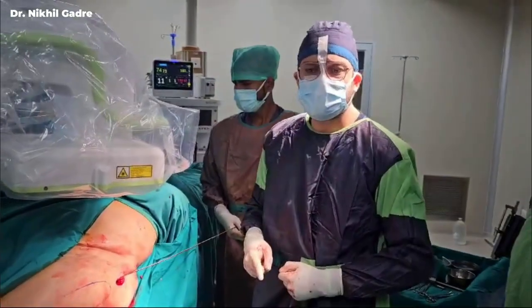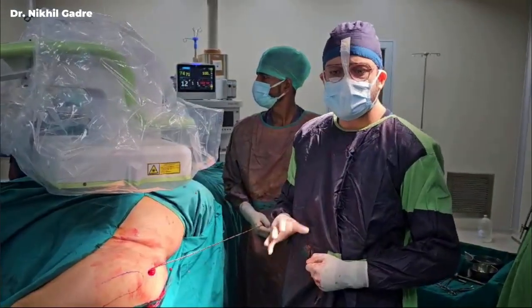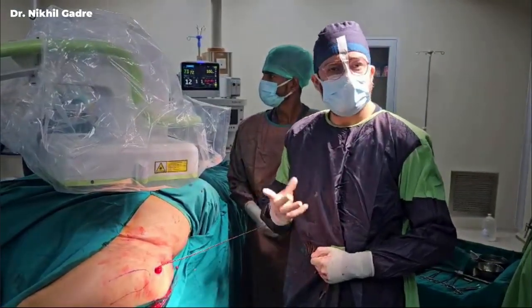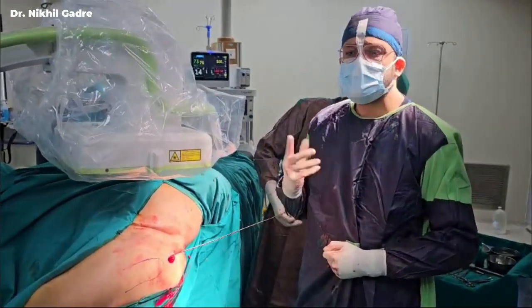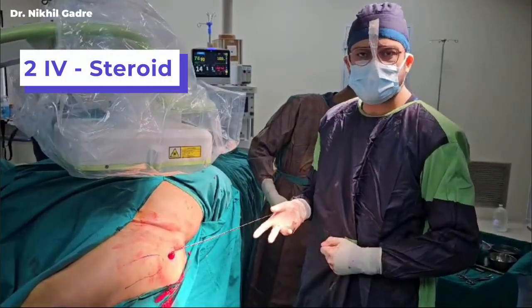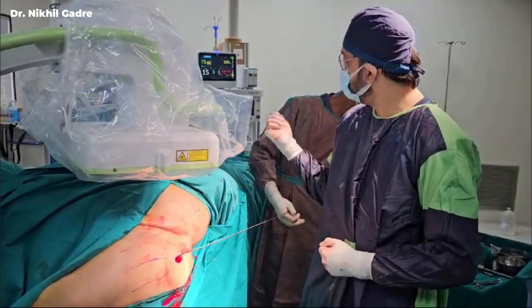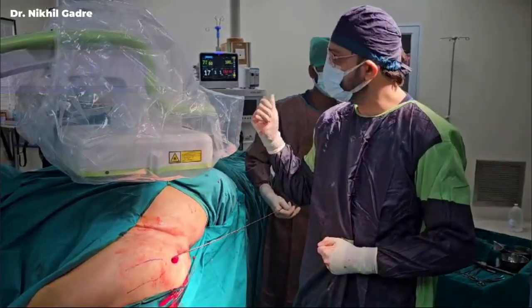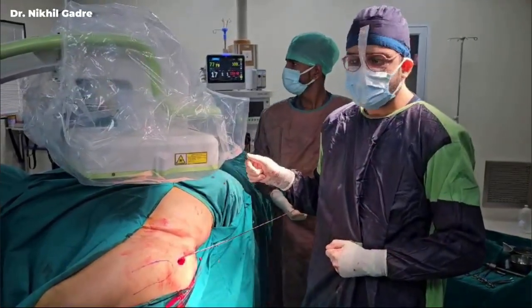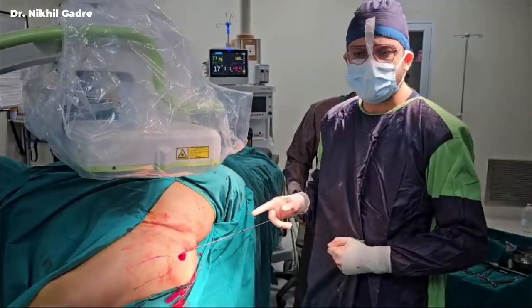In femur nailing, there is a big risk of fat embolism and pulmonary embolism. So the measures I take to prevent or minimize embolism are, one, before reaming, after the guide wire goes in, I give 2 IV doses of steroids, hydrocortisone 100 mg and dexamethasone 8 mg. Oxygen is kept at around 6 liters per minute and IV fluids are kept at 120 ml per hour. We always monitor the urine output so that your patient doesn't have a fluid overload.